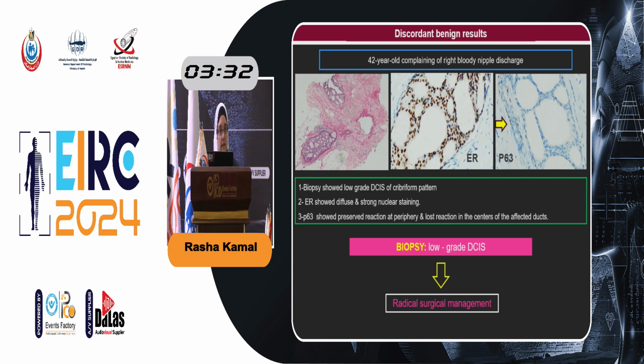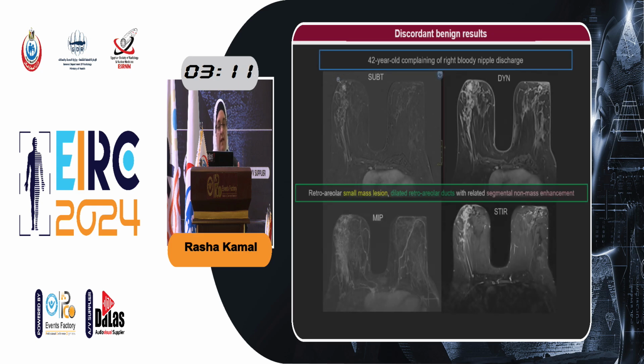And immediately in the MDT, when a DCIS is diagnosed, the surgeon will ask the pathologist and the radiologist, I should proceed to radical surgical management, but what should I do? Should I do a conservative surgery or a mastectomy? And in this case, we usually need to proceed to another, more advanced imaging modality. And as I told you at the beginning, the best modality is MRI.